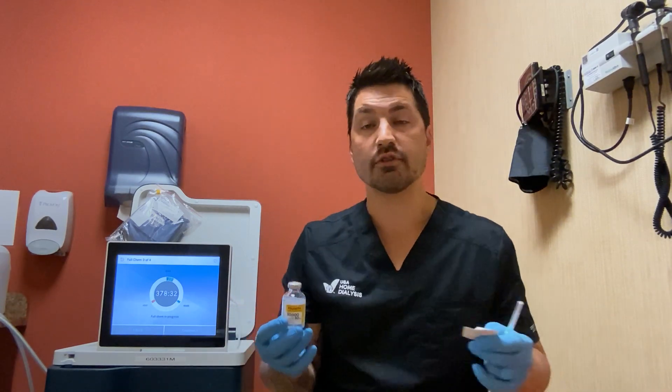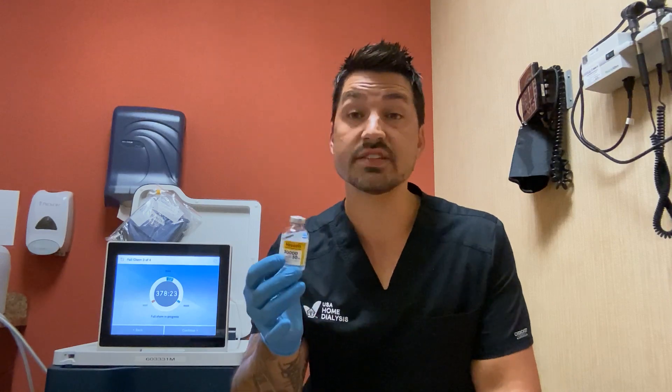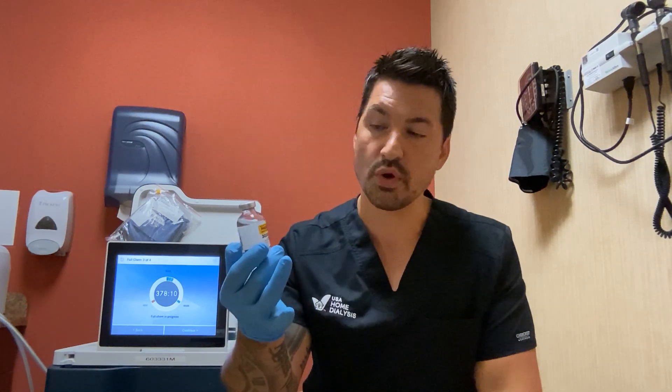For example, if your heparin bolus order is for 4,000 units to be given pre-treatment, you would withdraw 4 ml. If your hep lock order is for 1,600 units, 1,700 units, or 2,400 units, you would pull out 1.6 ml, 1.7 ml, or whatever the according conversion is.